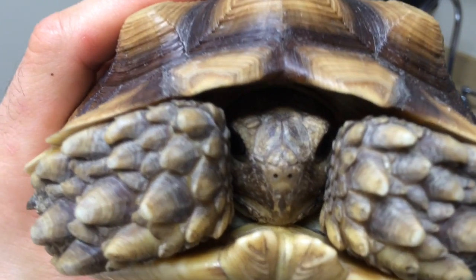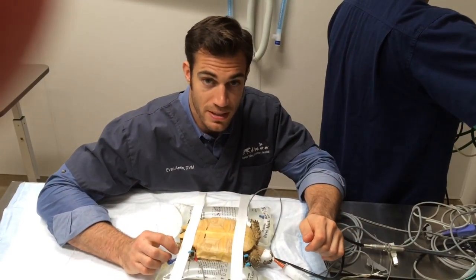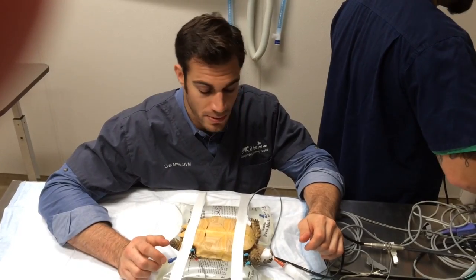Hi, I'm a tortoise. Today's surgical patient is a sulcata tortoise.